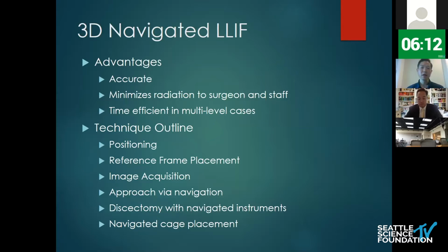And this has all resulted in the ability to use navigation for other aspects of the procedure beyond pedicle screw placement, which is what it was well known for. And so I'm going to present a 3D navigated lateral. And there's a number of advantages, and I'm going to go through every step very clearly. Now we have about 6 minutes, and that's going to be, I think, more than enough.